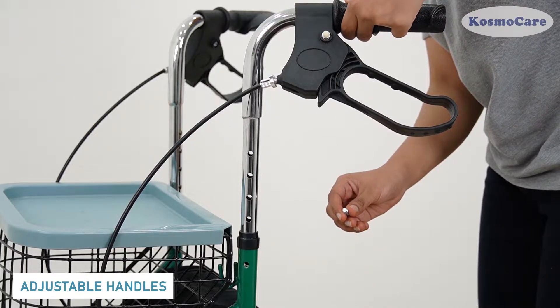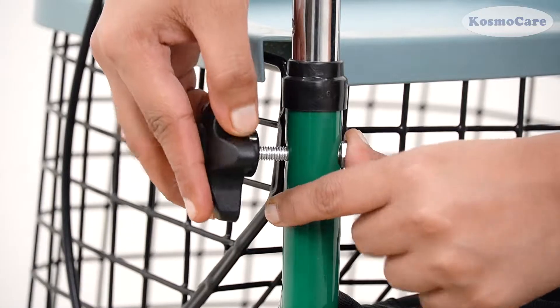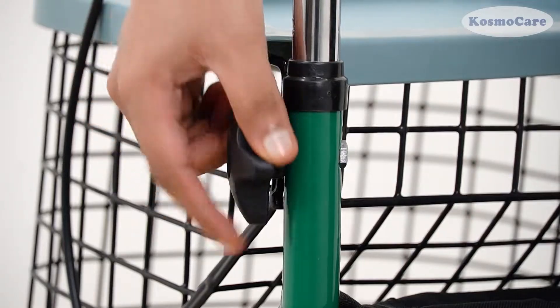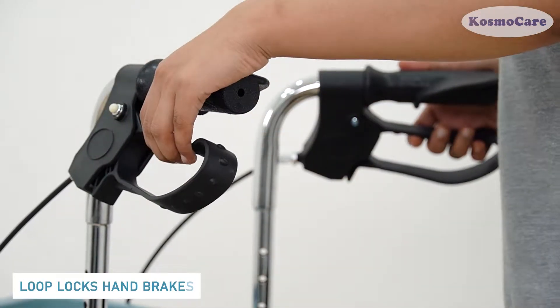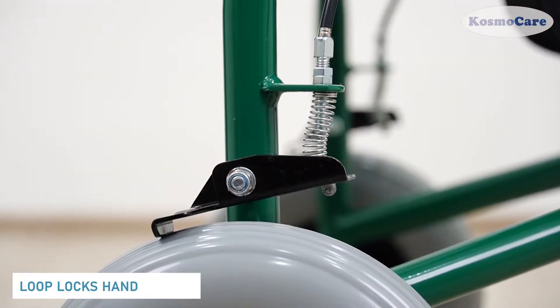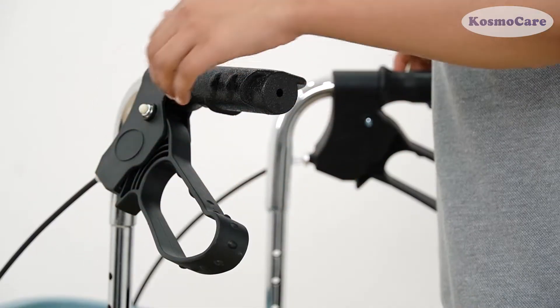The ergonomic handles are height-adjustable and are easy to grip to reduce pressure on wrists and forearms. In addition, these loop locks operate like a bicycle handbrake to lock the wheels by simply pushing down on the lever.